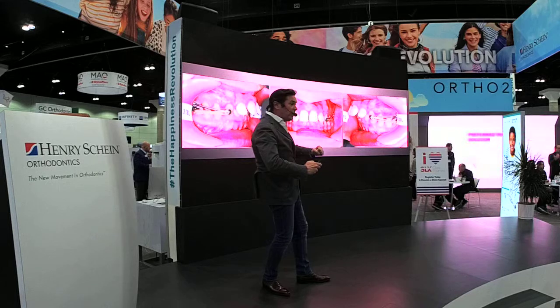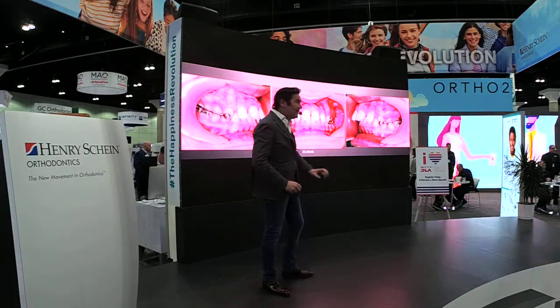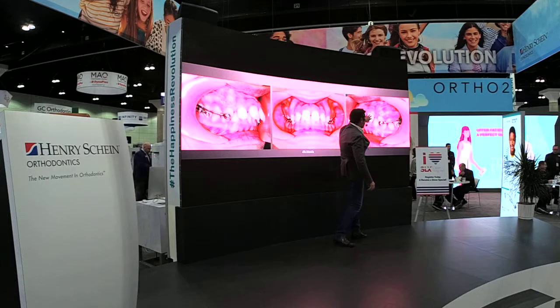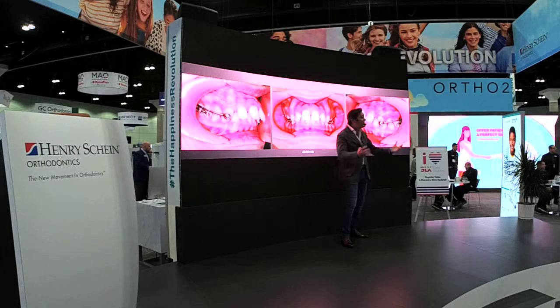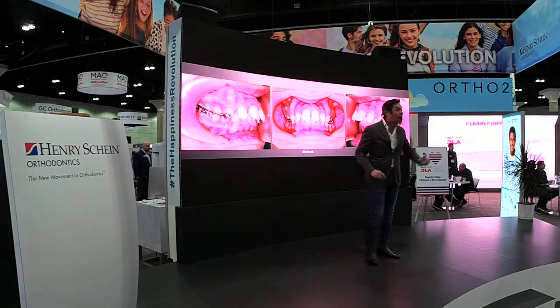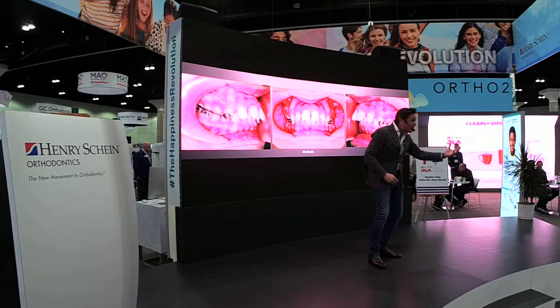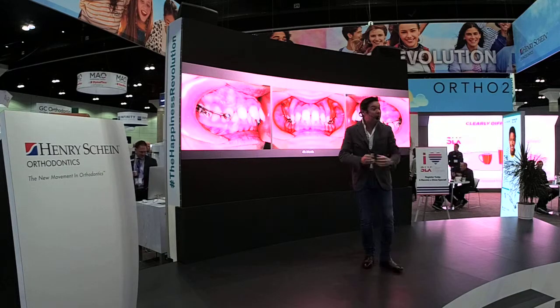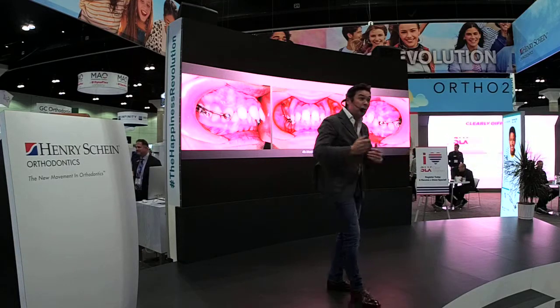This is 4 months after, 2 months after, and 4 months after we accomplish super class 1. Now we have a solid occlusion in class 1. Now we have beautiful spaces. Now we are able to finish this case either with brackets or with aligners. But amazingly, we have converted a case that was impossible to be solved with aligners into a case that is absolutely easy to solve with aligners or brackets.